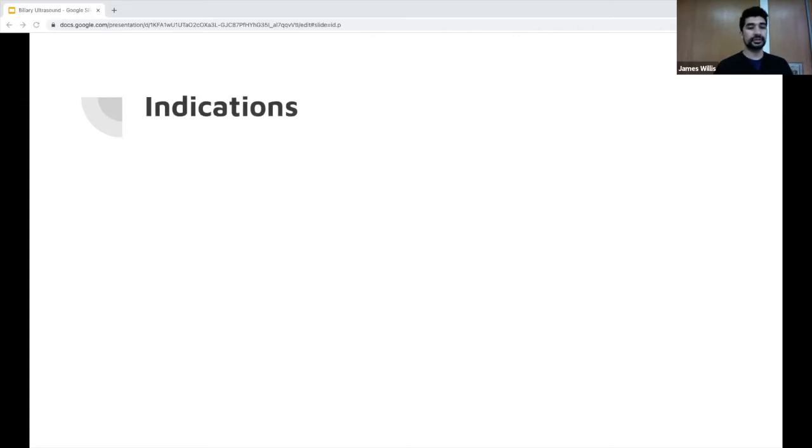So first, we're going to talk about the indications. I wanted to ask the juniors, what are some indications for doing a right upper quadrant sono? You can just shout them out. Yeah, good. Right upper quadrant pain. All right, any other indications? Yeah, jaundice is a good one.